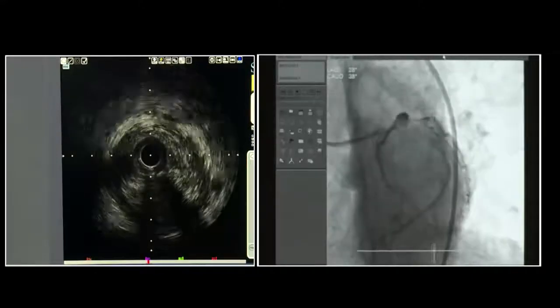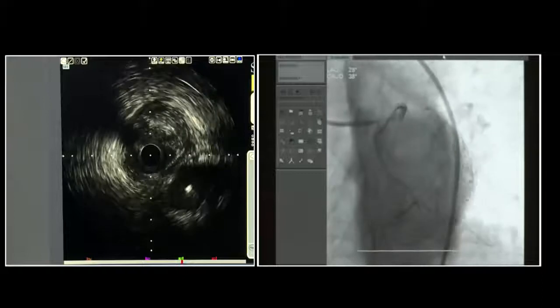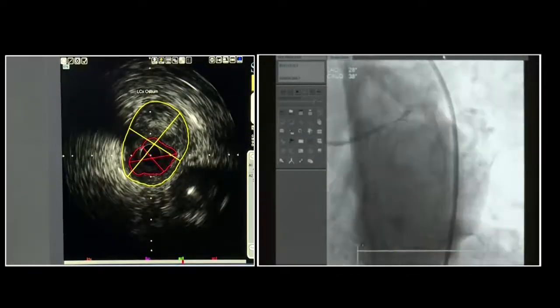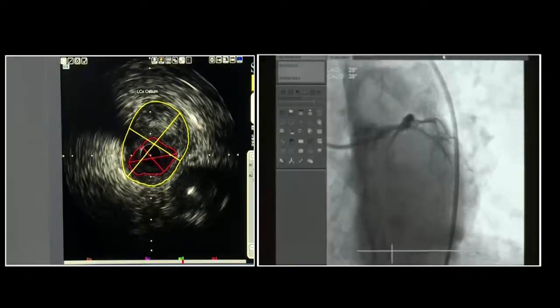I think there is a marked disparity in this size. Yes, there is at least marked disparity from circumflex to left main, so mini crush or at least DK crush will be the technique of choice angiographically. Or TAP technique, will it be okay, sir? What about it?